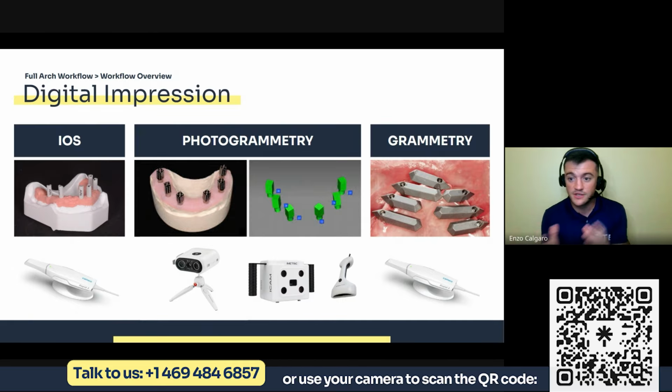It can be any scanner, you're going to be able to scan with those two. And photogrammetry, if you're talking about real photogrammetry, nowadays you have mainly two options. Either you use an extraoral equipment like a PiC camera, an iMetric, a Micron Visioneer. There are a couple of different options out there. And you would still need an intraoral scanner.